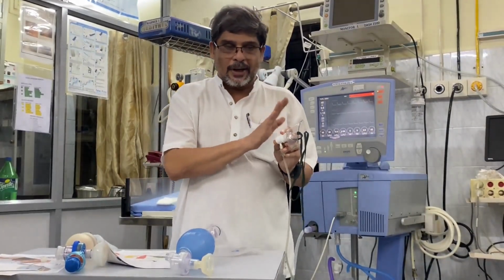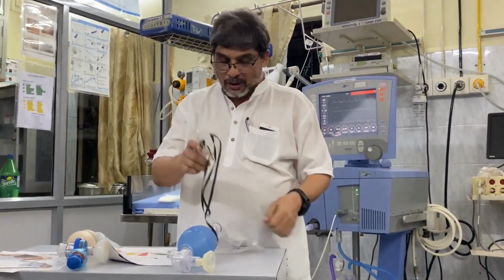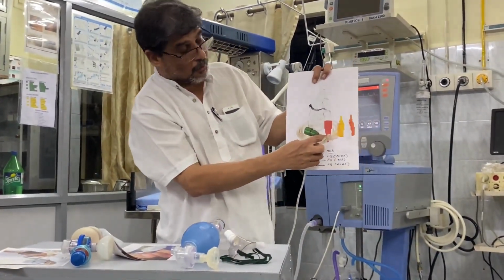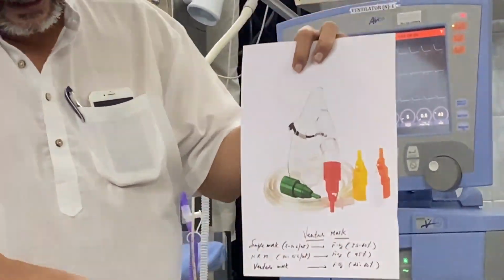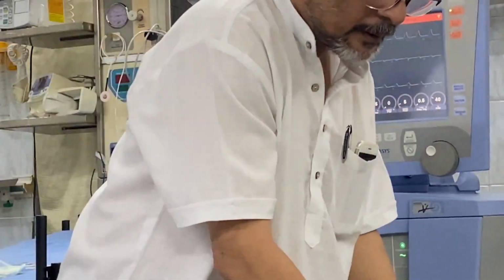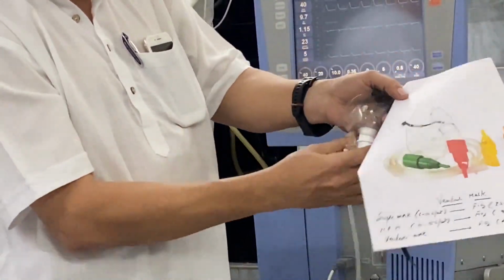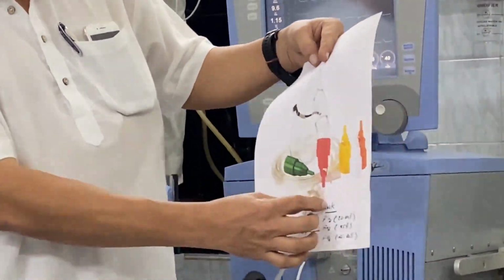If your patient is not maintaining with this simple mask, next you switch over to something called a Venturi mask. Venturi is nothing but adapters which have got the regulators inside, and you fit this to the adapter, and this adapter fits to different types of masks.